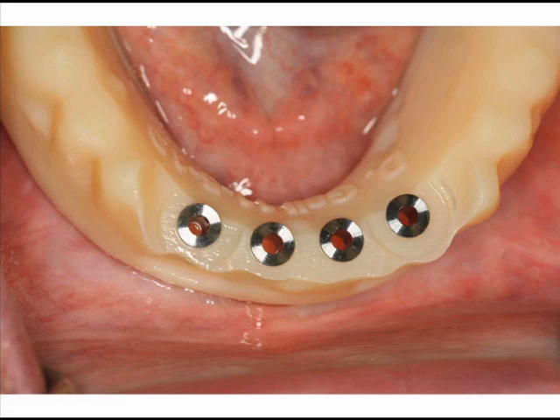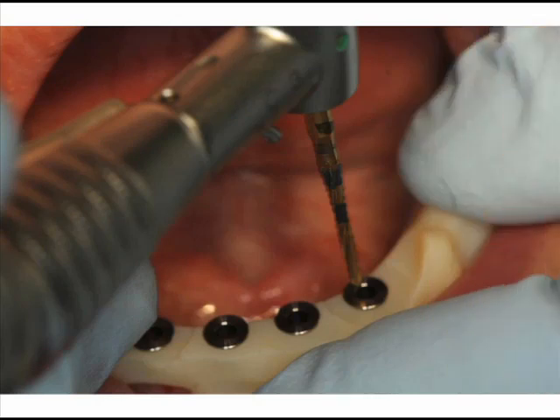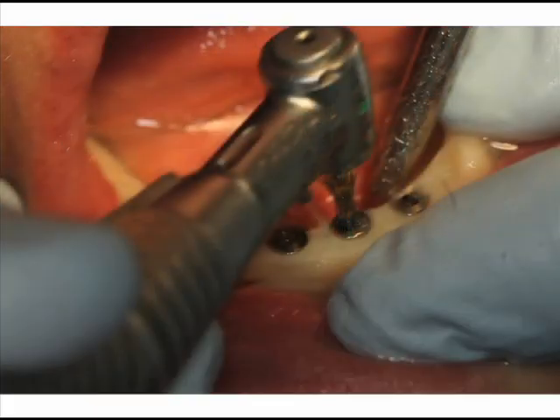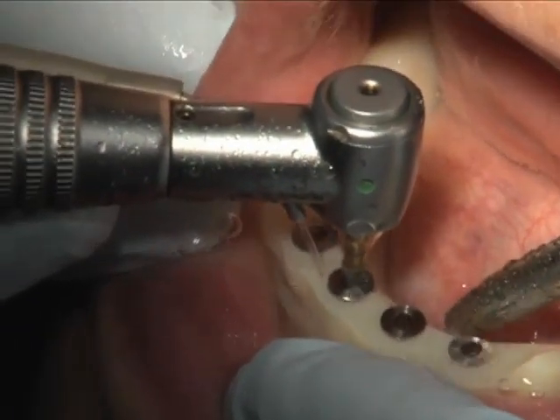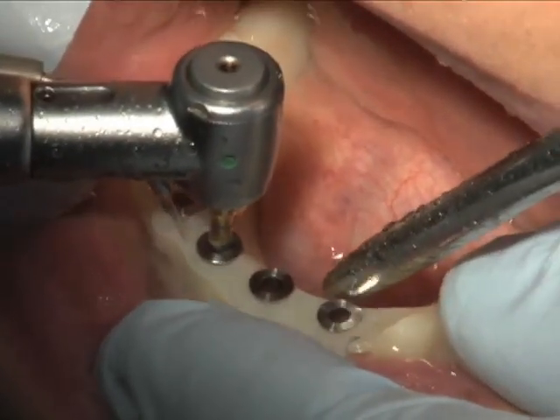But you have to remember that the conventional denture has to be well-fitting and stable prior to fabrication of any surgical guide. The following figures demonstrate the use of a small diameter pilot drill, which was used through the sleeves of the surgical guide to create proper angulation and position of the 4 small diameter implants.